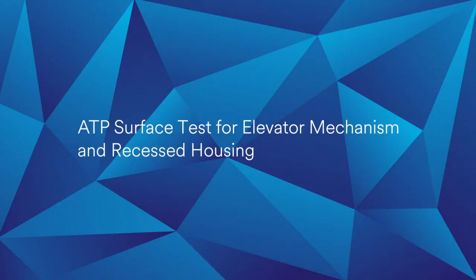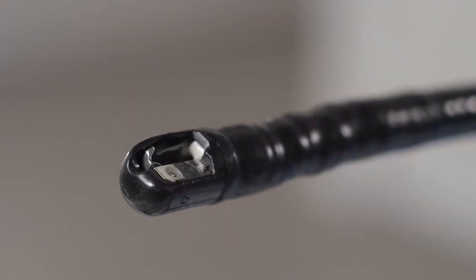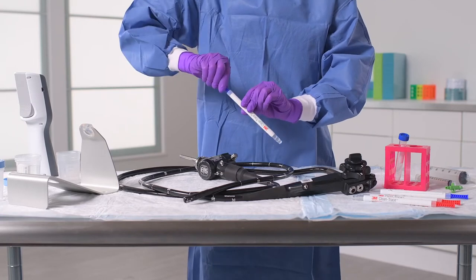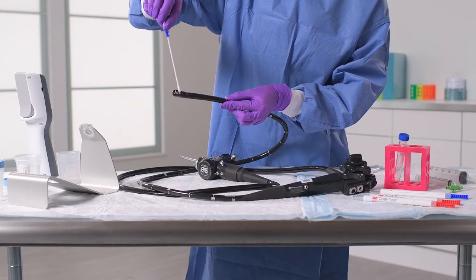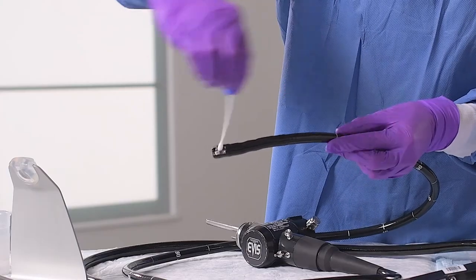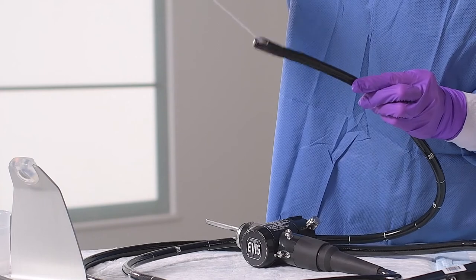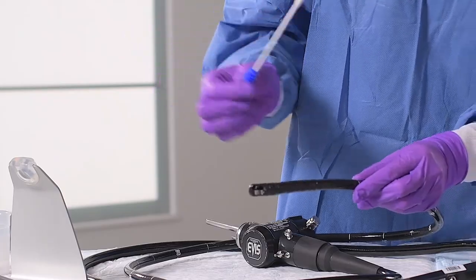Next, we will perform a surface test for the elevator mechanism and recessed housing. To begin, turn the control knob so that the elevator mechanism is in the down position. Using a new surface test UXC, swab the exposed parts of the elevator mechanism and the recessed housing, rotating the swab as you collect your sample. Swab all visible surfaces as thoroughly as possible and remember to apply enough pressure to cause the wand to flex.